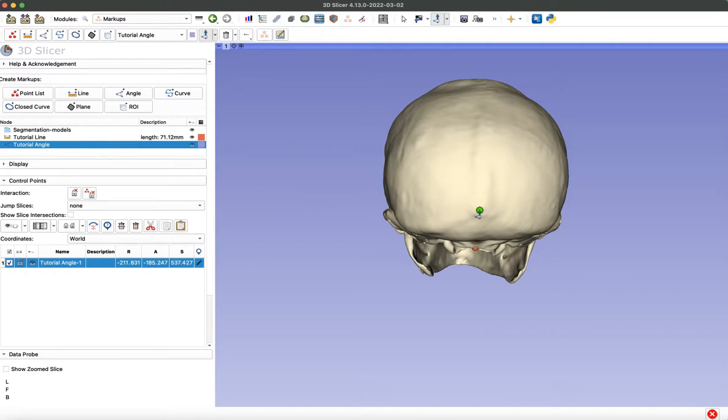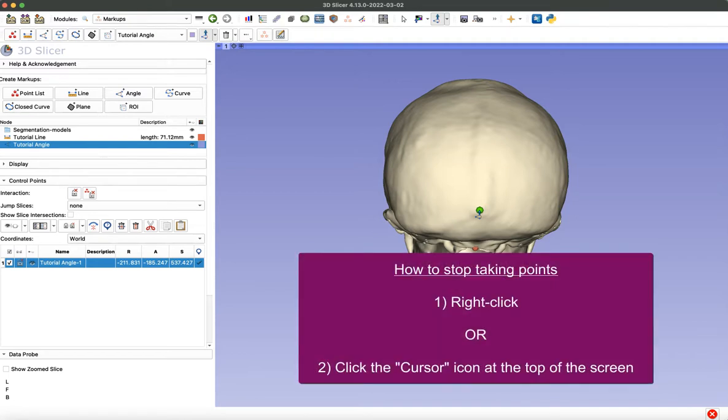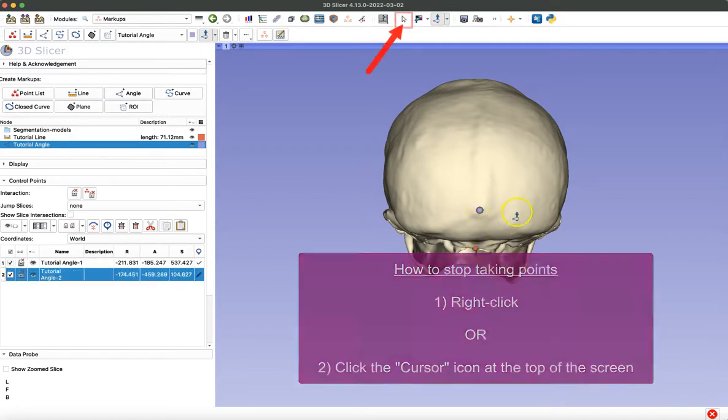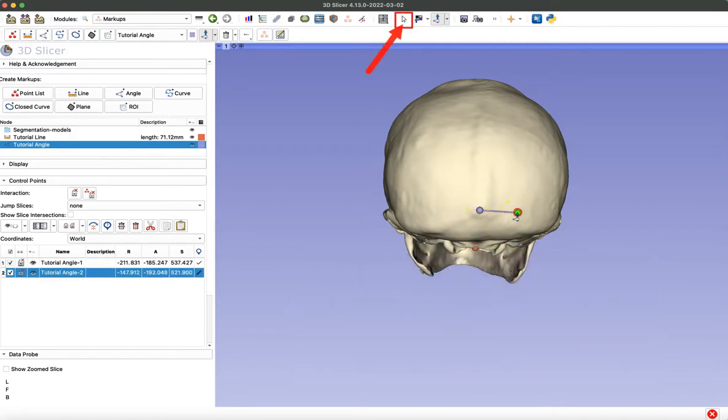Now the other two points of our angle we've already taken. So I'm going to pause here for a second and show you one trick that I use all the time. So to stop taking points, you either right click or click that cursor icon at the top of the screen.